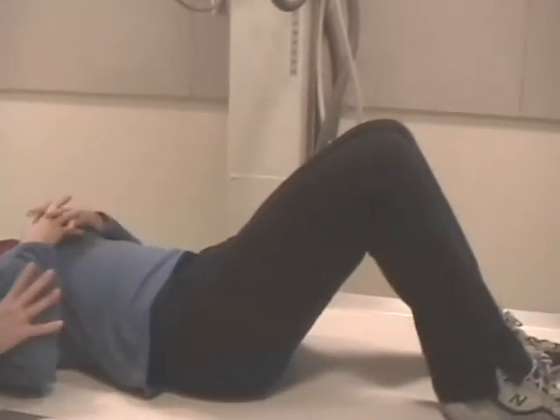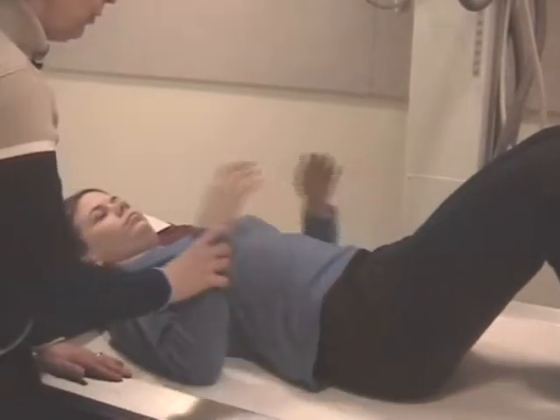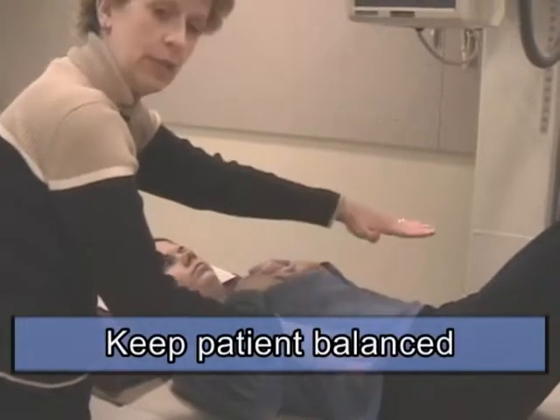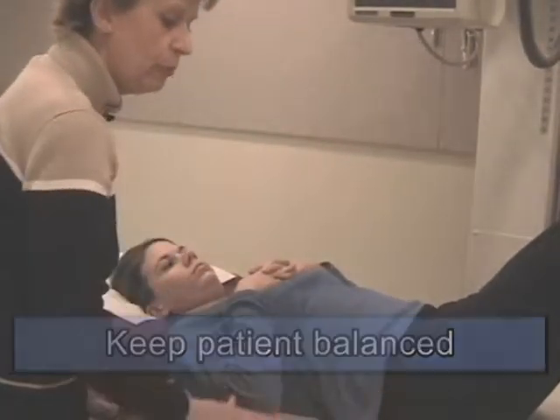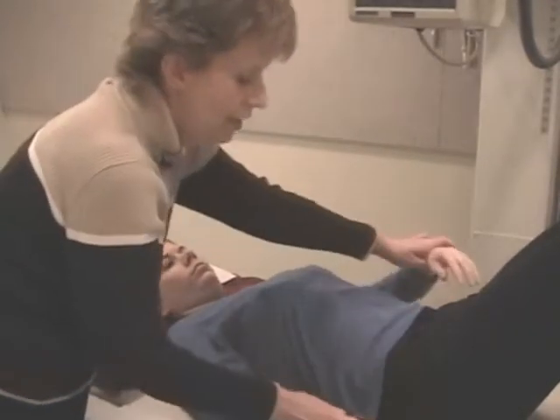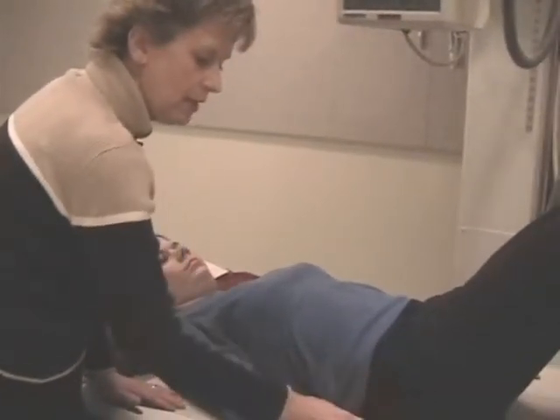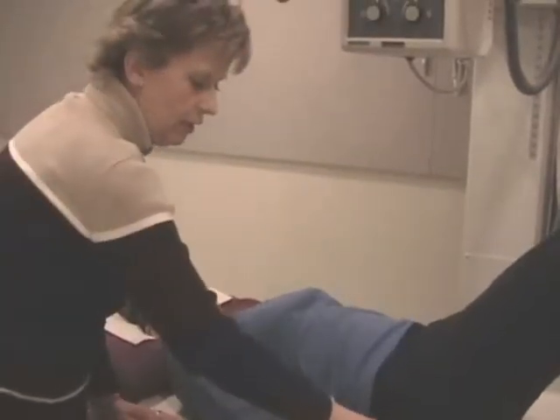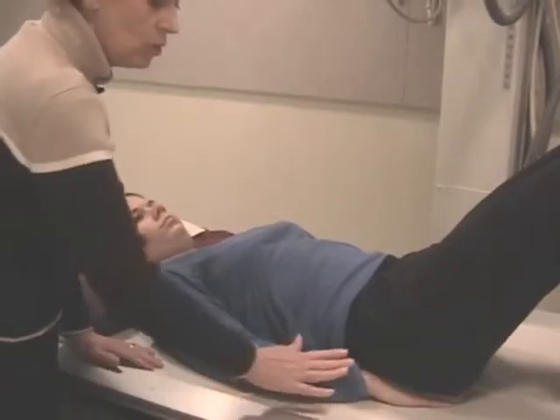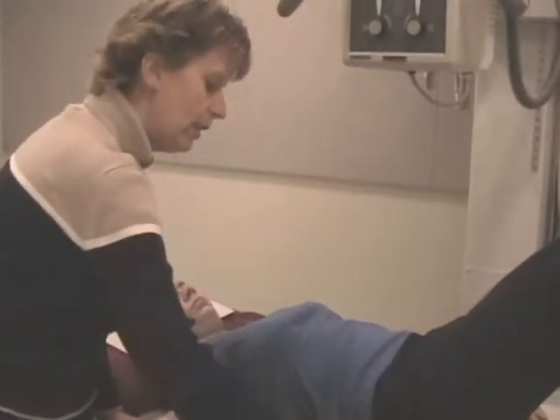There you go. Now the patient's hands can be either both down to their side or both up at the same plane. This will help to keep the patient balanced and not rotated. Again, either both down or both up. I caution you when they're down because patients that don't have a lot of adipose tissue on the back of their sacrum will tend to slip their hands underneath, because the table's hard. For comfort, they'll tend to slip their hands underneath. So watch out for that if the hands are down to the side. We'll need to bring them out.